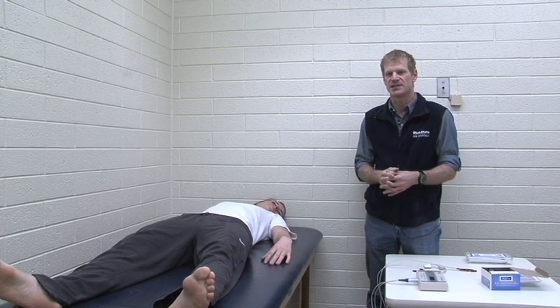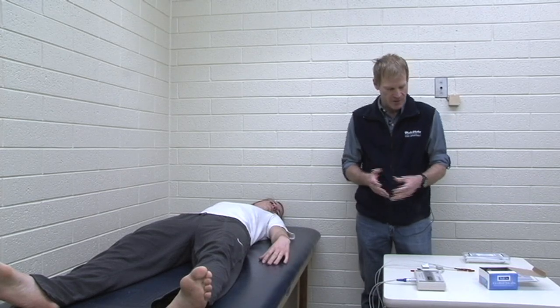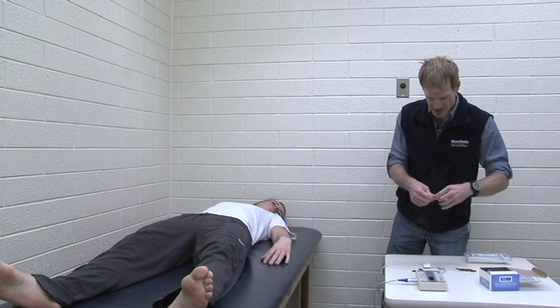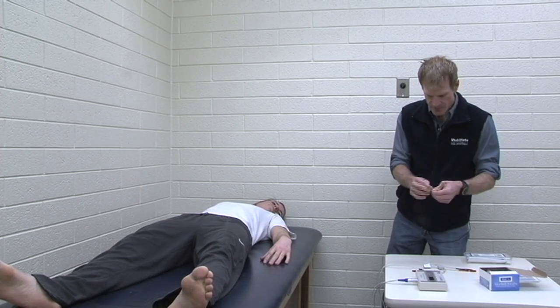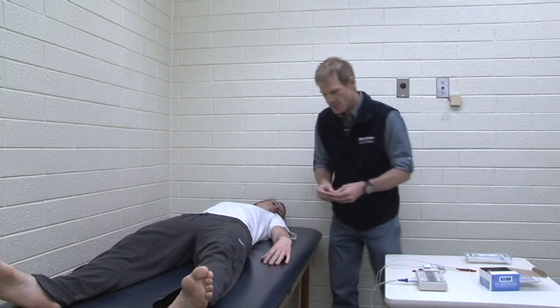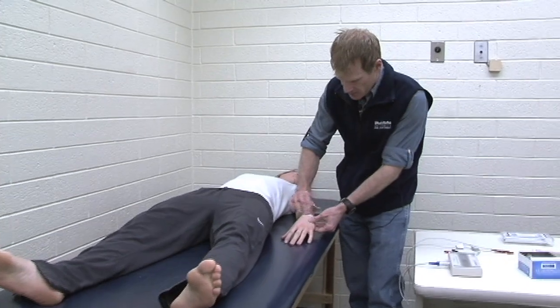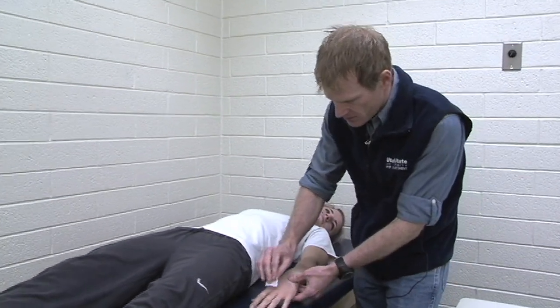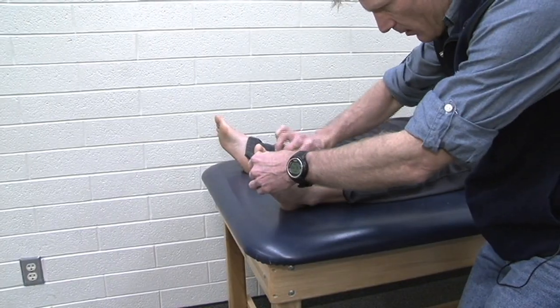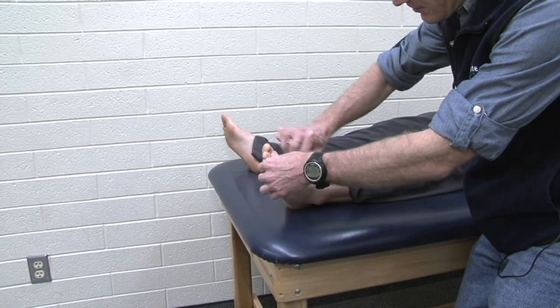We're measuring the impedance, or the resistance to the electrical current going through the person's body. The first thing we're going to do is clean up some areas on our subject's skin so that we have good conduction. We're going to be placing four electrodes — two electrodes on the wrist and hand, and two electrodes on the ankle and foot.